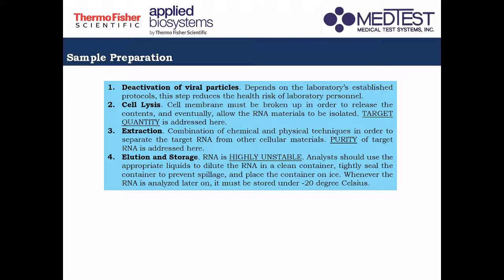Then the next, which is the extraction step. So the extraction step is a combination of chemical and physical techniques in order to separate the target material, which is the RNA, from other cellular materials. So we don't want contamination from our workflow.